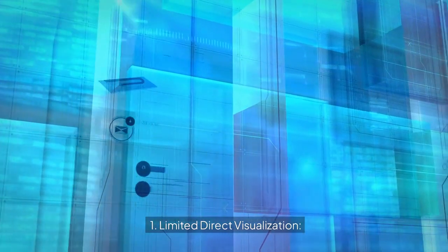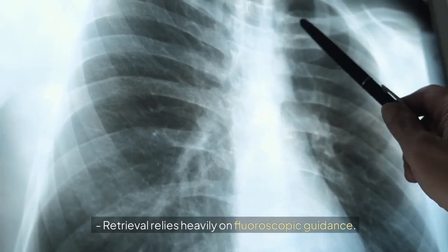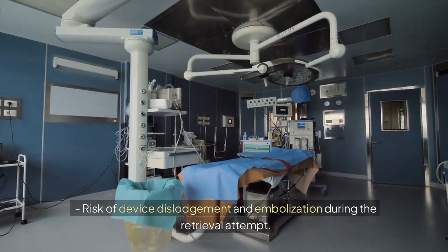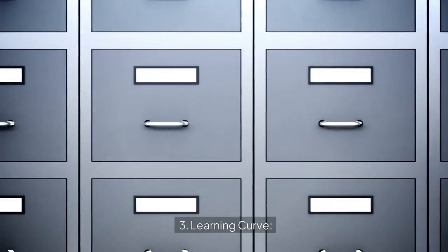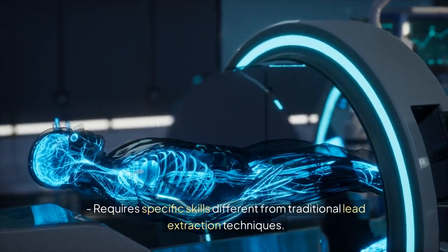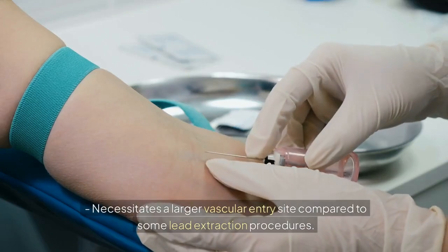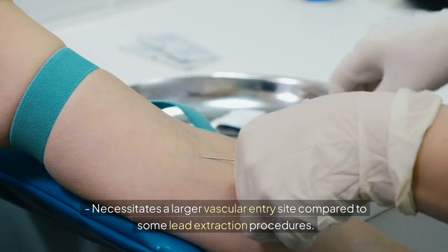1. Limited direct visualization. Retrieval relies heavily on fluoroscopic guidance. 2. Potential for embolization. Risk of device dislodgement and embolization during the retrieval attempt. 3. Learning curve. Requires specific skills different from traditional lead extraction techniques. 4. Large bore vascular access. Necessitates a larger vascular entry site compared to some lead extraction procedures.